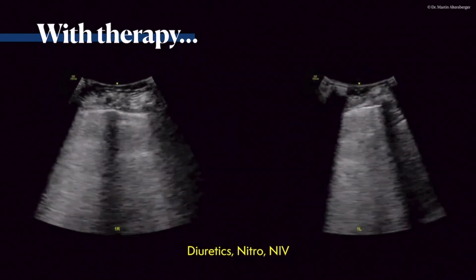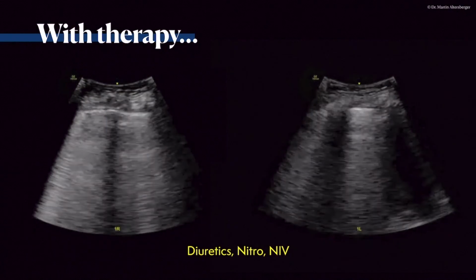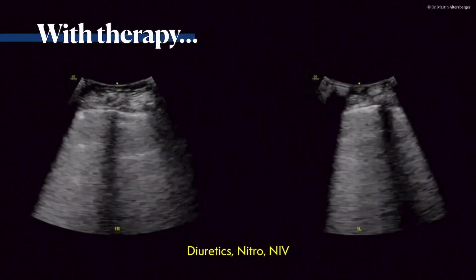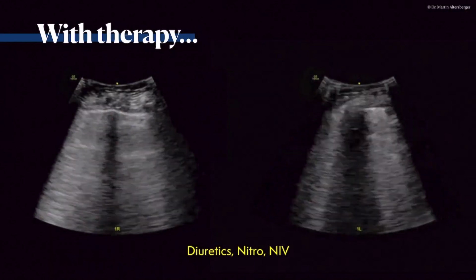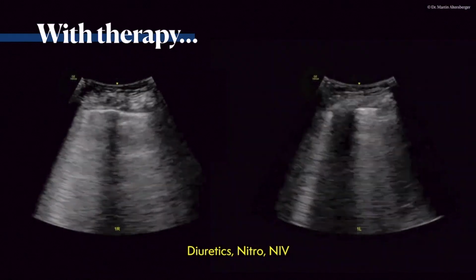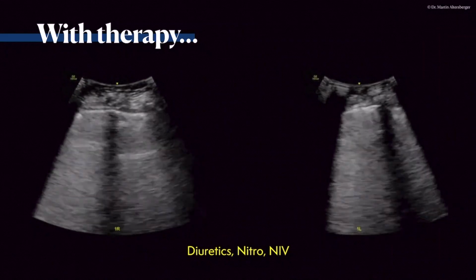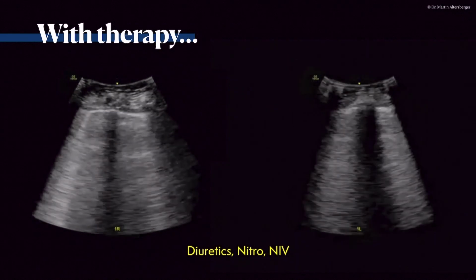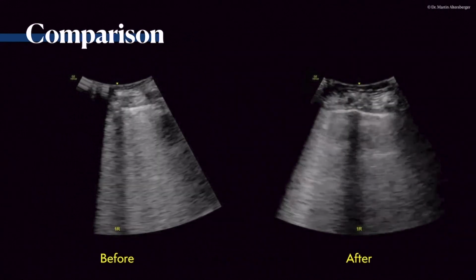And it responds very nicely to therapy, with diuretics, nitroglycerin and CPAP, so non-invasive ventilation. Very quickly you see that this is the pleural line. There are still some artifacts present, but you see other artifacts as well, so-called A-lines, the mirror artifacts of the pleural line, indicating that there is less free lung water present. The same is on the left side, you see A-lines and definitely fewer B-lines. And our patient was also feeling much better just briefly after we initiated therapy.